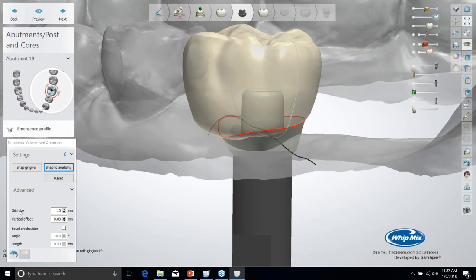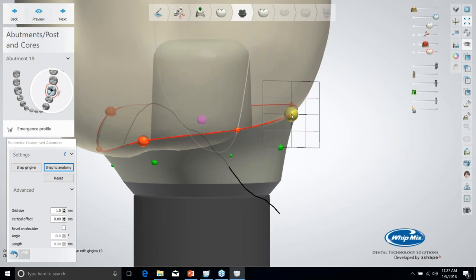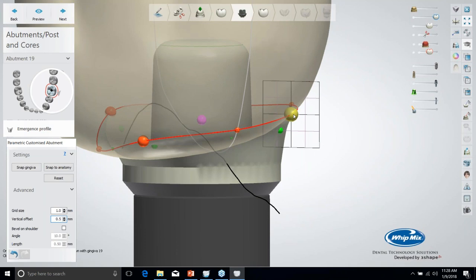A couple options under advanced over here. You have the grid size, which is 1 millimeter. If you do want to change your grid size, you can just by adjusting this value. Vertical offset: when I adjust this emergence profile, it adjusts all the way down to the tie base. If I increase this vertical offset, it protects the first however many millimeters I specify here. So let's say half a millimeter. Now when I adjust it, that first half a millimeter stays a complete vertical cylinder that's the size of the platform.